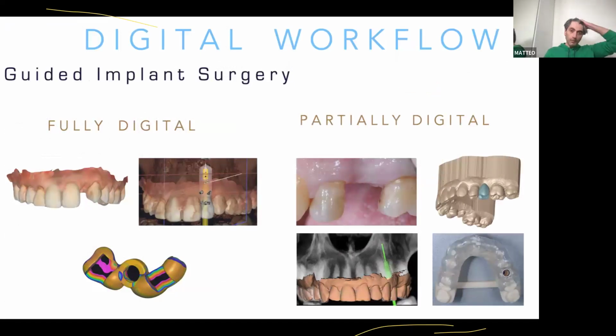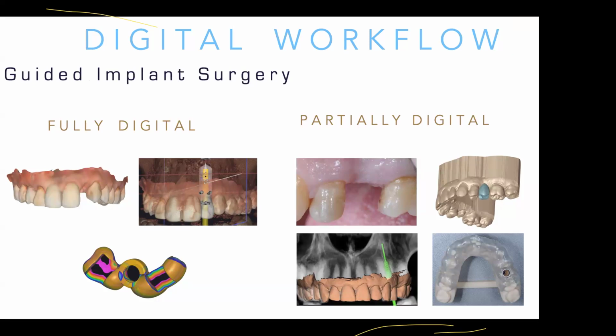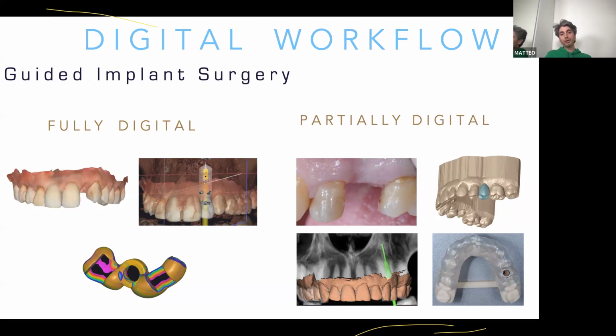So, to do a guided surgery, we can go fully digital or even partially digital. To go fully digital, we need the intraoral scanner.